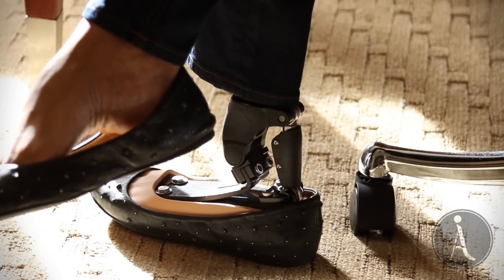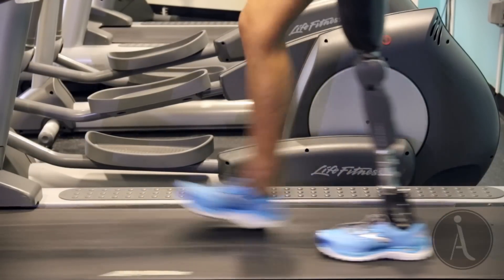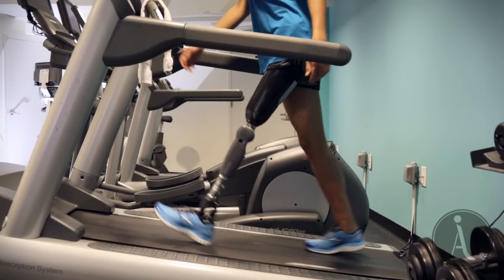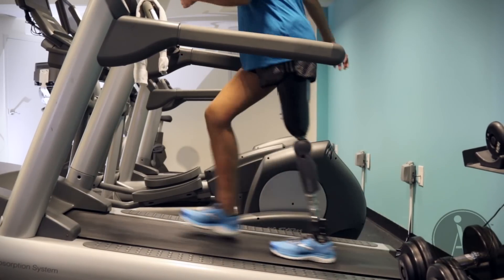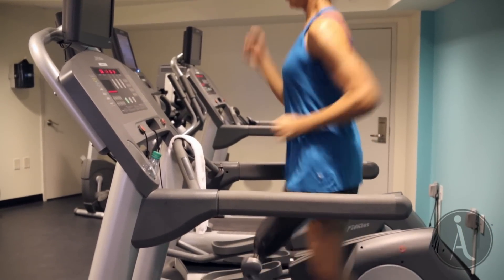The Rione 3 Enhanced simulates the natural function of a physiological knee joint and produces fast, accurate response to changes in direction, speed, and terrain, allowing for a natural gait pattern with proportional speed and performance.